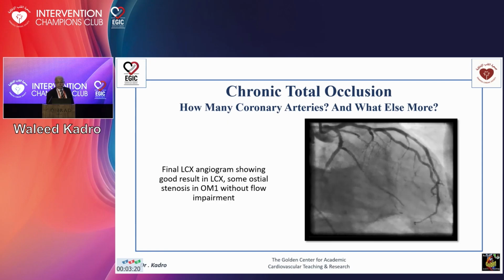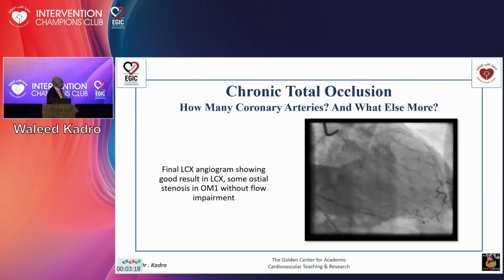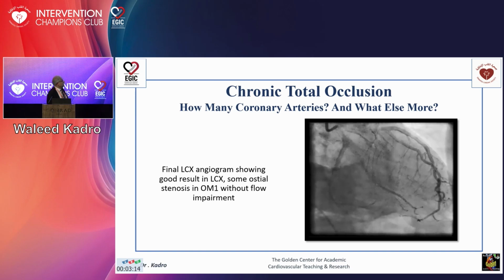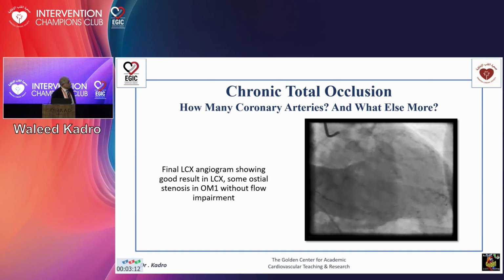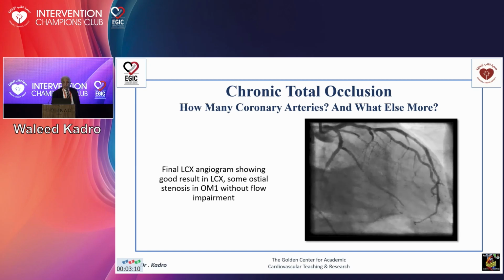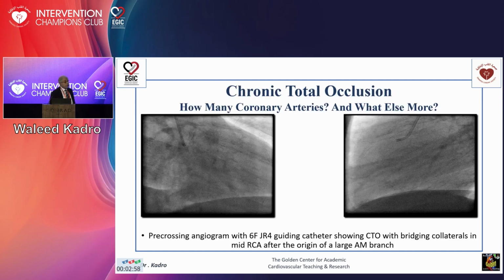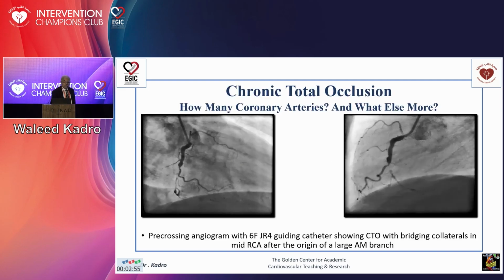After stenting, we get this final nice angiogram, although the ostium of the OM has a pinch, but I would not do complex intervention for this bifurcation. So we kept our promise to the patient. We did not send him for surgery, and we sent him home and brought him back just 2 weeks later to do the intervention for the total occlusion of the RCA.